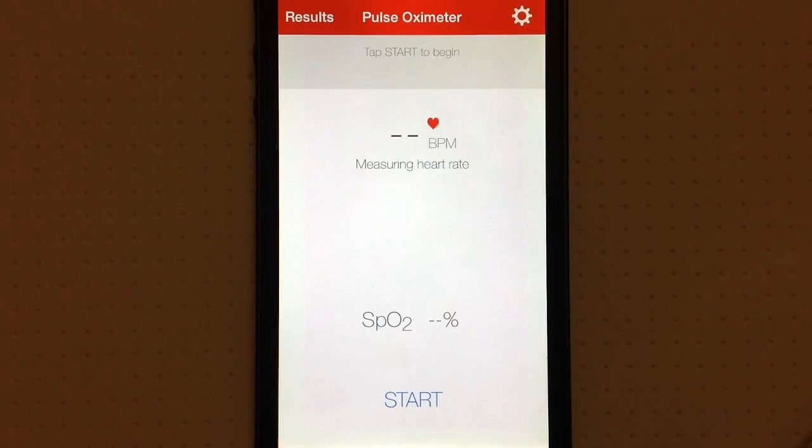There could be a number of reasons why you'd want to get an accurate measurement of your heart rate and blood oxygen levels — primarily health. If you're an athlete, you like to keep tabs on stuff like this. Pulse Oximeter is a great way to go. As a disclaimer, it's not intended to replace doctor visits or actual pulse oximeter hardware. Always keep that in mind whenever you're using apps that serve a medical purpose — it definitely does not replace an actual doctor.